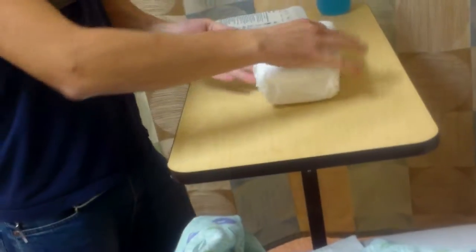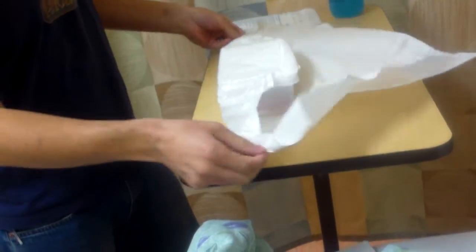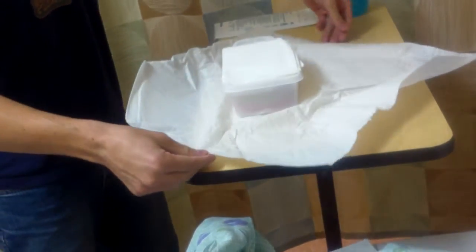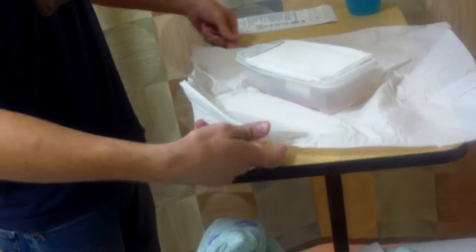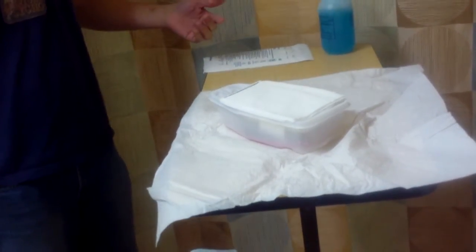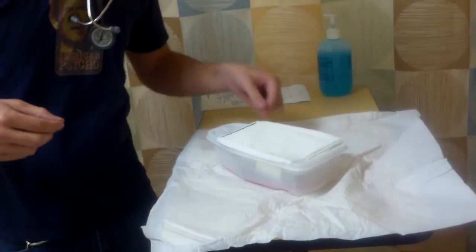So then, opening the kit away from me, only touching the outer edge of my tray here. Alright, so that's good. Next I'm gonna take my sterile drape here. Just looking for the right part to grab. I'm gonna grab that, only touching the outer edge. Okay, kind of get that unfolded.